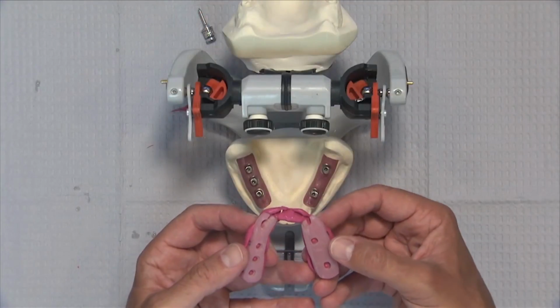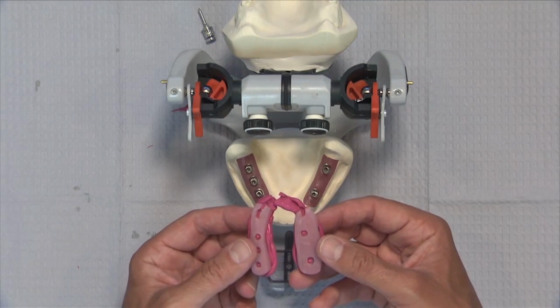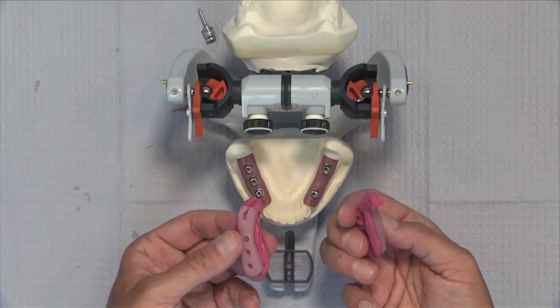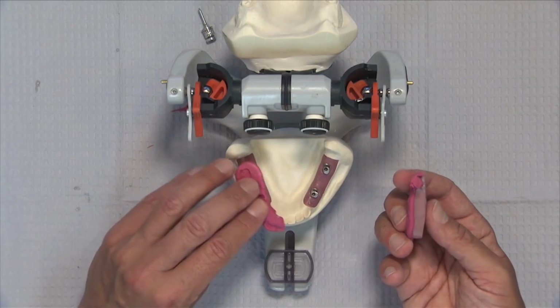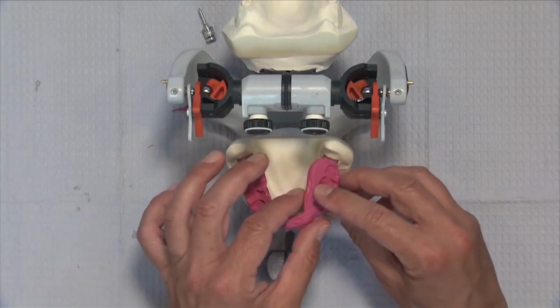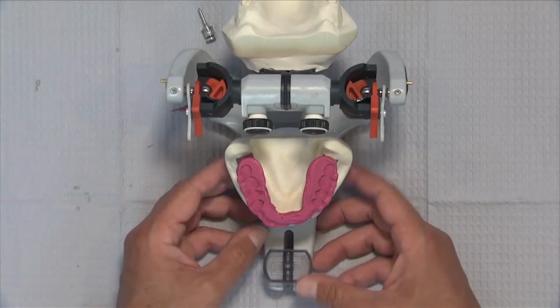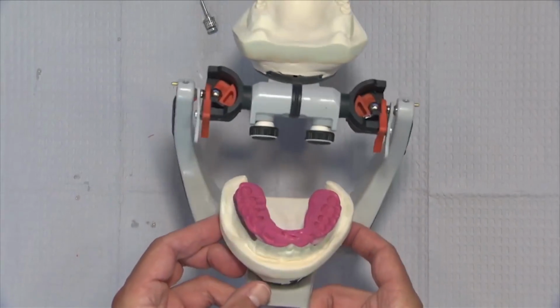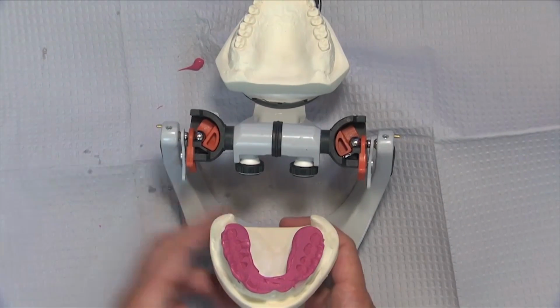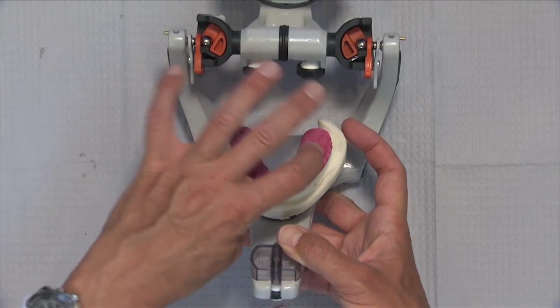So here's our bite registration. It's now in 2 pieces because this patient has stone teeth instead of wet enamel, so it's stuck a little more. But you can see how accurate this is. It's actually kind of a nice thing that it's in 2 pieces because as we put these sections back and seat it back onto the custom abutments, you can see how perfectly it fits together. I mean, the tolerances here are fantastic. It sits right back onto those custom abutments, and this is just as solid as it gets.